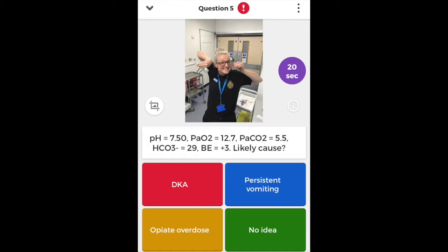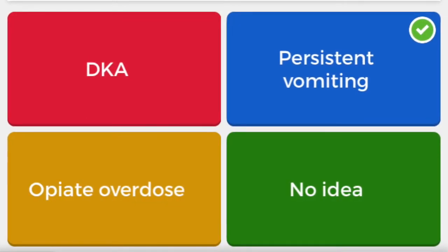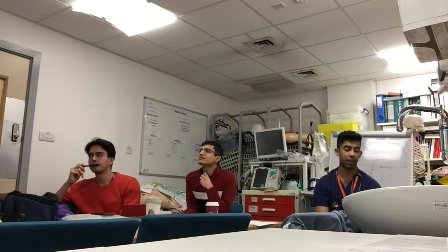It's getting a bit trickier. Okay, interpret the gas. What is it? Metabolic alkalosis. Very good. And so why do we think it's persistent vomiting? Yeah, it's because you're vomiting up the hydrochloric acid, so you lose it. All right, very good. Isn't the bicarb also within normal range? 28. Oh, okay. It's good that you know now, though.